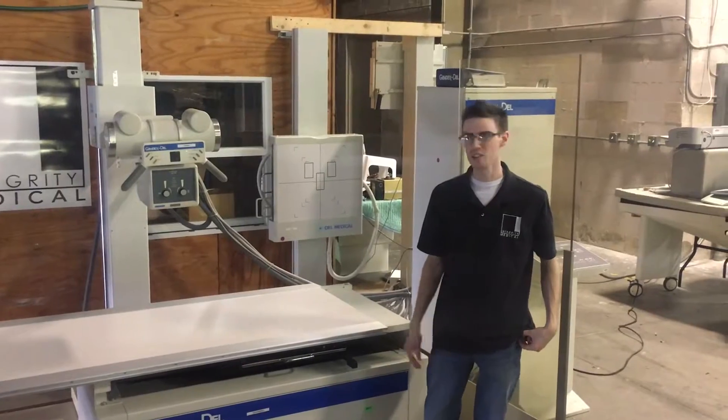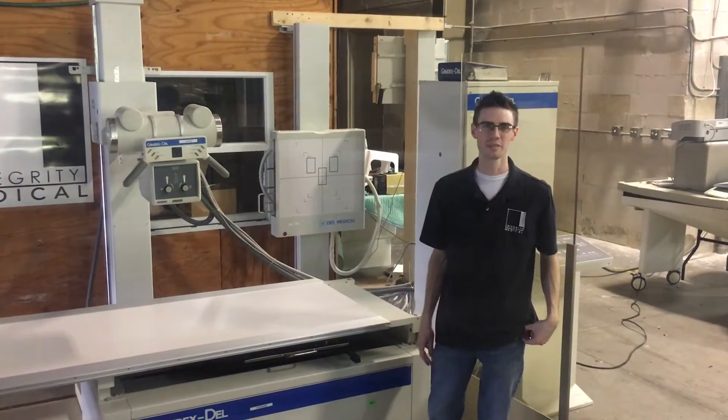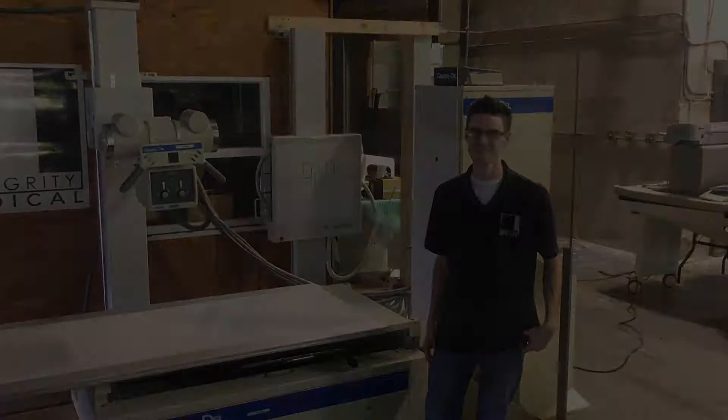I have just demonstrated to you how to use the Gendex ATC525. Please contact Integrity Medical Systems for all your x-ray imaging needs. Thank you.